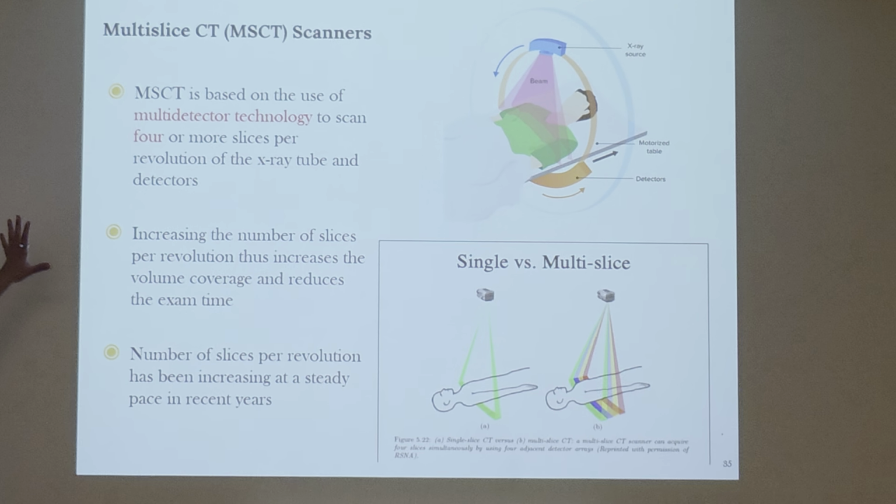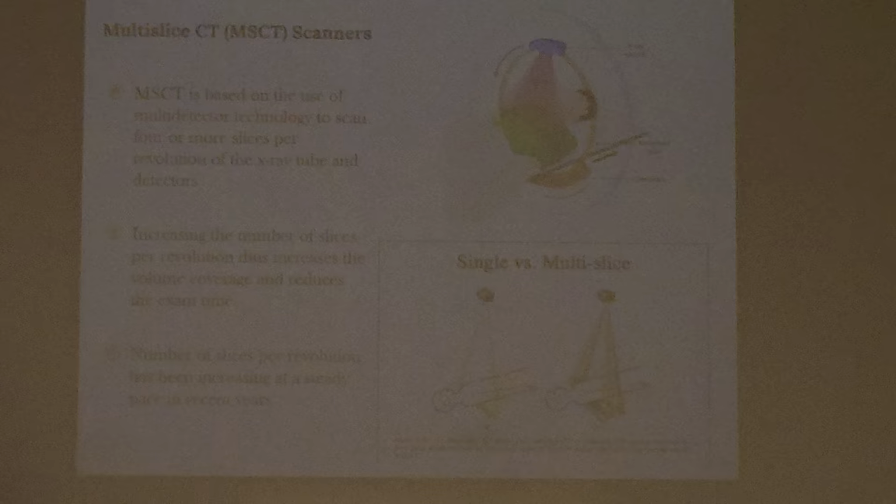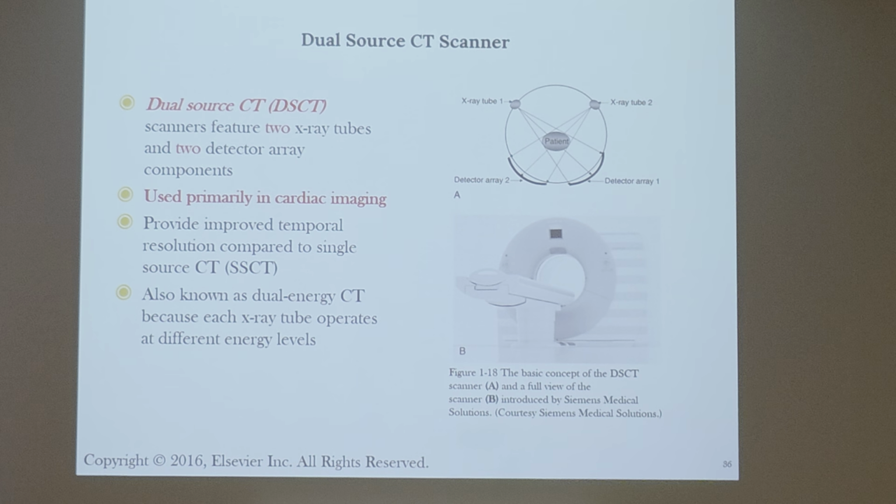All right, so do we know the difference between a multi-slice CT scanner versus a generation number 2? What is the difference? It's not going to be the width of the detectors, right? So it's not going to be side by side this way, but it's now going to cover volume. More volume and less rotations or more rotations? Less rotations, perfect.